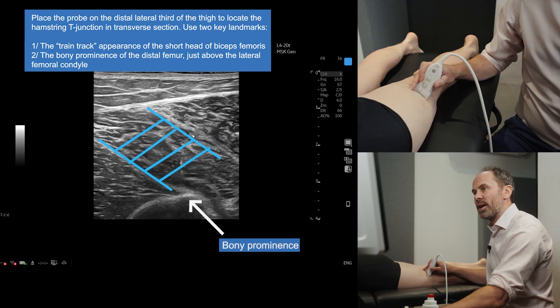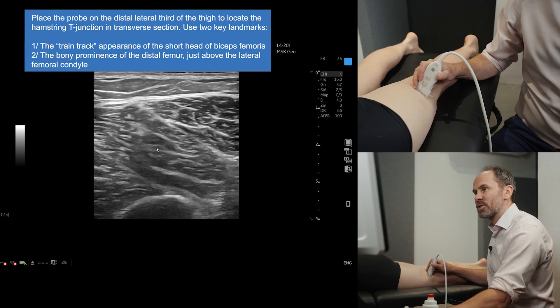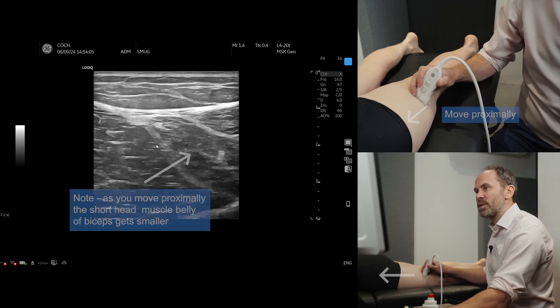Here's one train line and here's the other. This column in the middle is your short head of biceps. To check that, you just go up and it will get smaller, and as you go down it will get bigger.